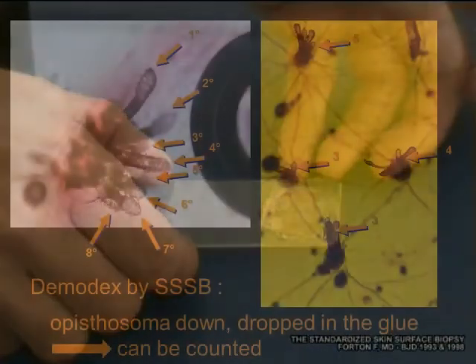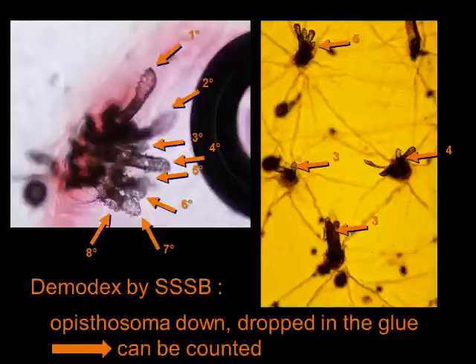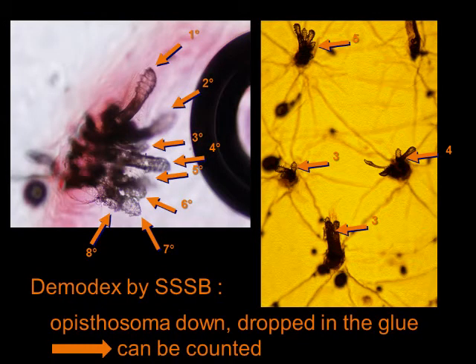Here on the left, we can count 8 demodex in the follicle, and on the right side we see 4 follicles with 3-5 demodex per follicle. By counting the number of demodex per square centimeter, we obtain the demodex density.